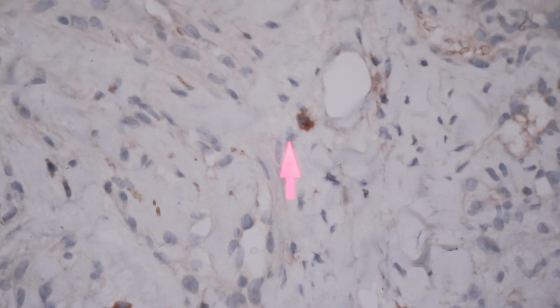when I see mast cell non-specific staining. And so here again is desmin. The little spindle guys in the background probably are some myofibroblasts. Sometimes they can express a little desmin. And then these scattered cells there, there, there, and up here, those are the mast cells. And you can see nicely the fried egg shape here. It looks like a little fried egg perfectly. And it's got weak cytoplasmic staining. So admittedly, when it looks like this, most people would see that. They may not know what it is, but they'd say, well, that's not specific staining. But next time you see it, you'll know that you're dealing with mast cells.